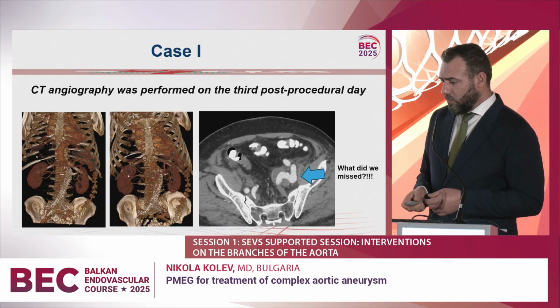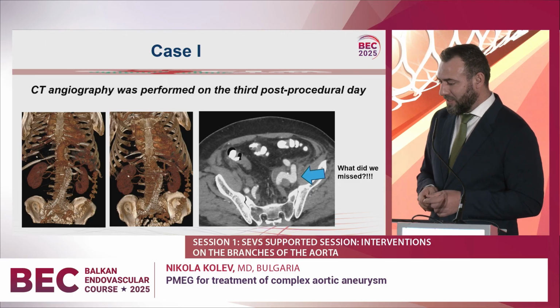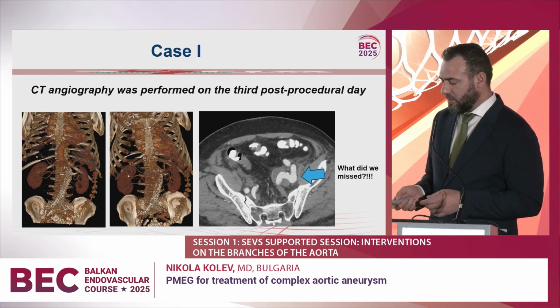And of course, what did we miss with the native CT? We missed that the patient had an aneurysm of the internal iliac artery. The results are pretty good, no endoleak, the patient is good, discharged, healthy.